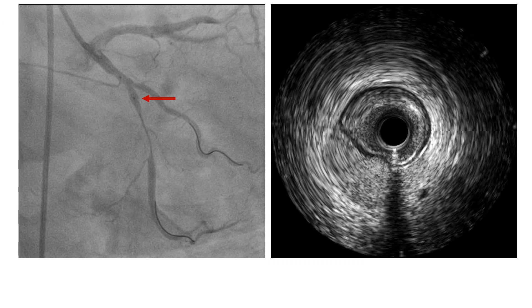In the proximal part, this is the hematoma and this is the true lumen. The way to differentiate hematoma from atherosclerosis is to look at the media, which appears as a dark circle on IVUS. Atherosclerotic plaque appears inner to this layer because it involves the intima, while the hematoma appears between the layers of the media or outside the media. In some cases, we can see the media is split into two parts.